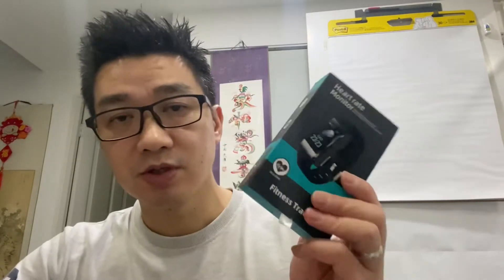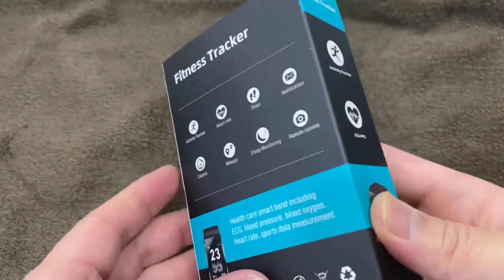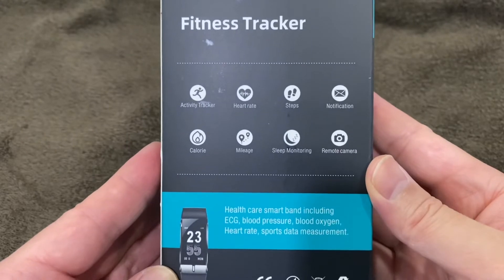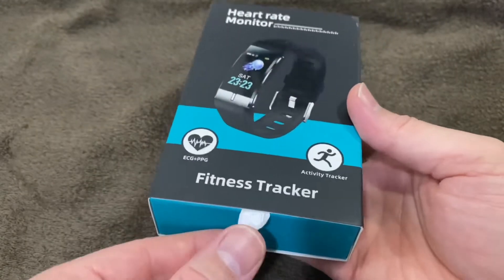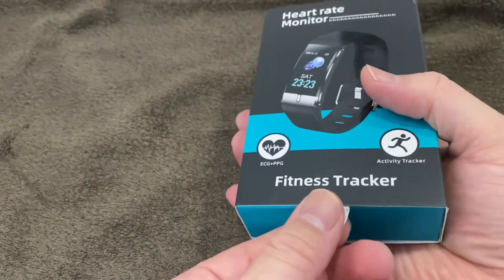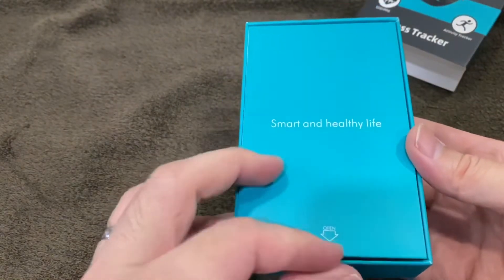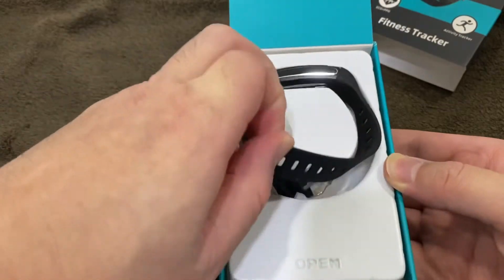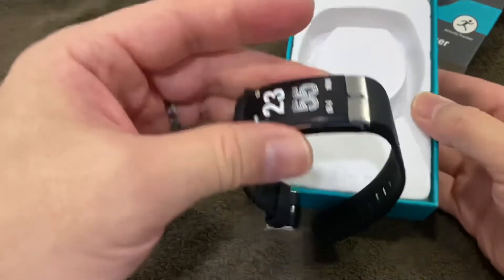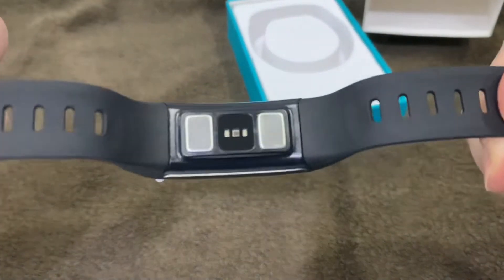Lo and behold, this actually really impressed me and I'll show you why. So this is the box — nothing special. Activity tracker. There's heart rate, steps, notifications, calories, mileage, sleep monitoring, and remote camera. Pull it open — smart and healthy. It looks like a reasonable watch. This was $45, around £25.